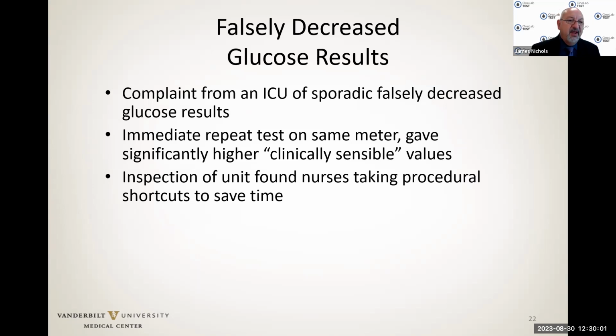What we found, though, is that although manufacturers had desiccants in the lid, the nursing staff had difficulty getting their gloved fingers into the bottle to remove a test strip. The manufacturer had made it very narrow to prevent a lot of airflow back and forth while the bottle was open and test strips were being taken out.